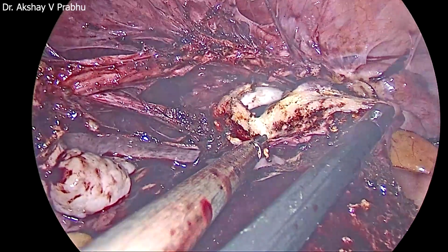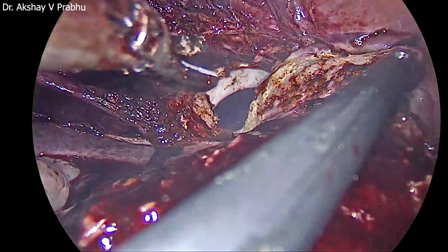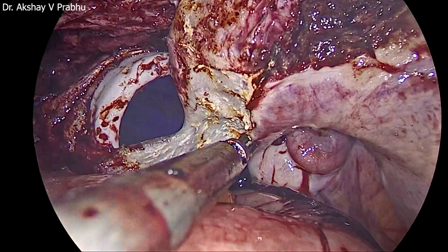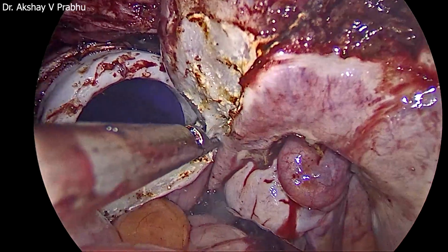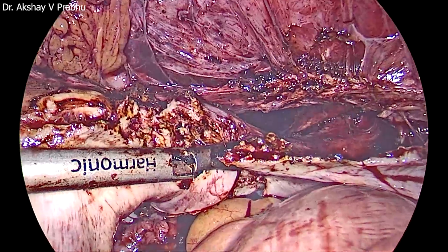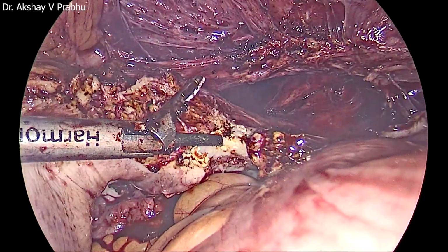You can see the tube was withdrawn. So we have reached the stage that the assistant does not have to be told that this has to be done. We are auto-tuned to those steps. Left side uterosacral has been cut. Slowly right side uterosacral will be cut and the specimen will be out. This is the right side uterosacral cardinal complex. You can see the uterine artery cauterized end.